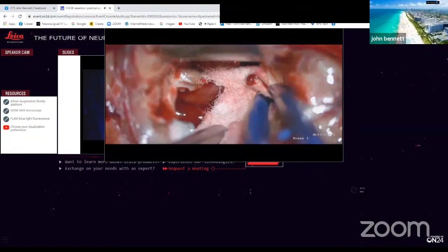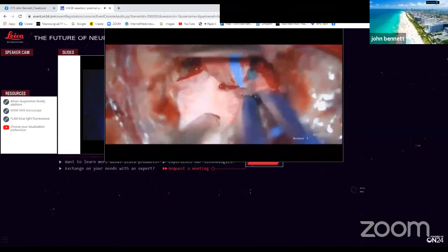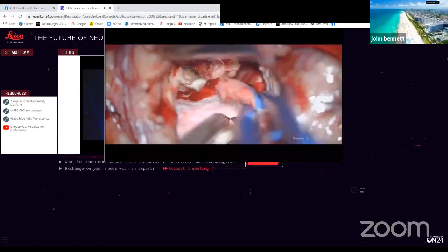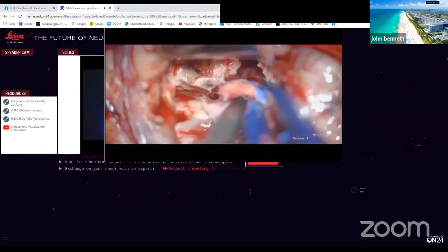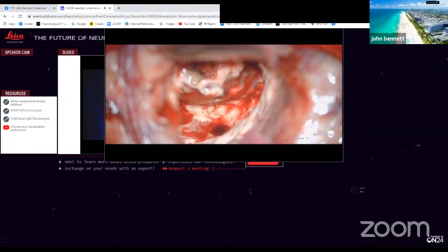Once you've seen now that we've gone from having fluorescent light to the normal white light as we are used to in a surgical microscope, one can then visualize the normal brain tissue. And at the 12 o'clock position, one can see areas that have the consistency of a normal brain tissue, and that you would be, as a rule of thumb, reasonably happy with your surgical resection.